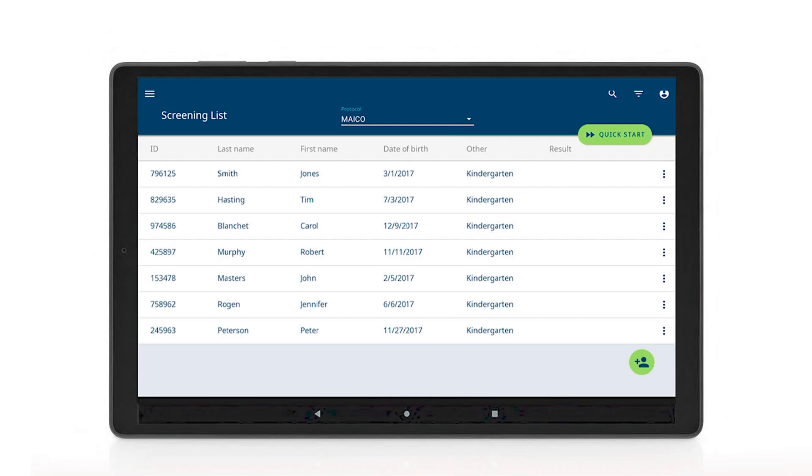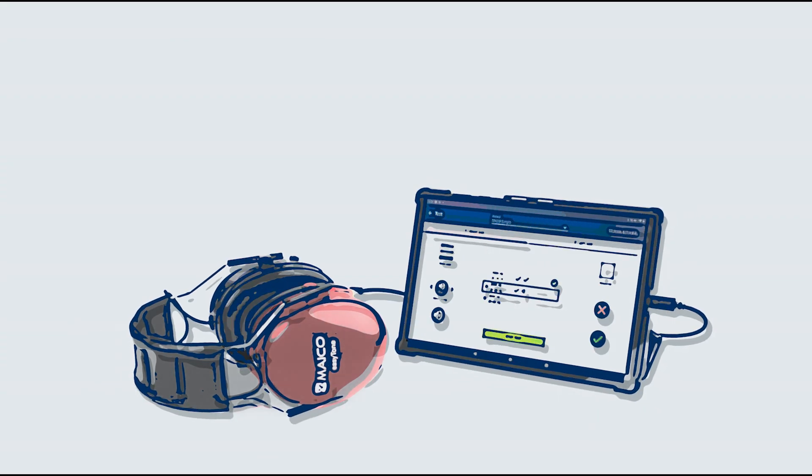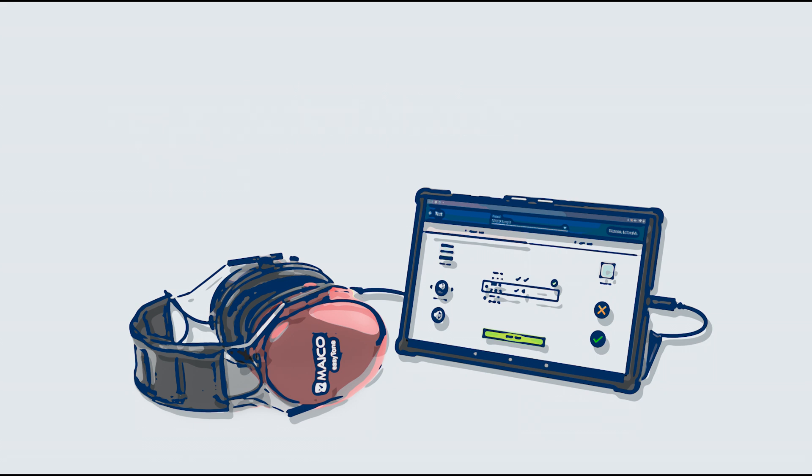This completes the tutorial on how to upload a subject list into the EZTONE app. Please continue through the tutorial series for additional EZTONE instruction.